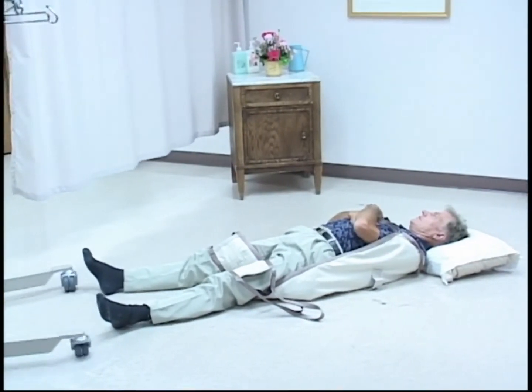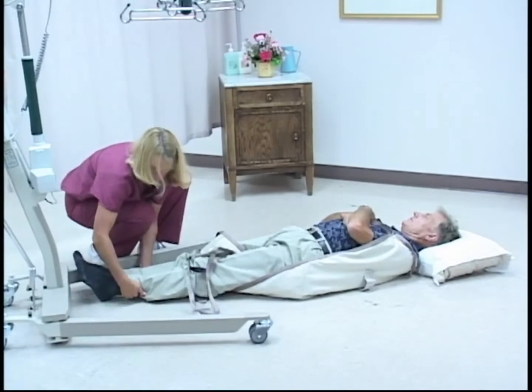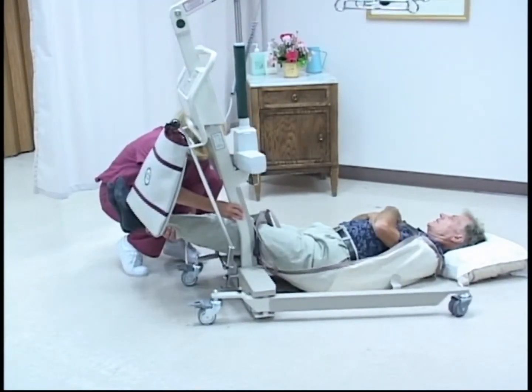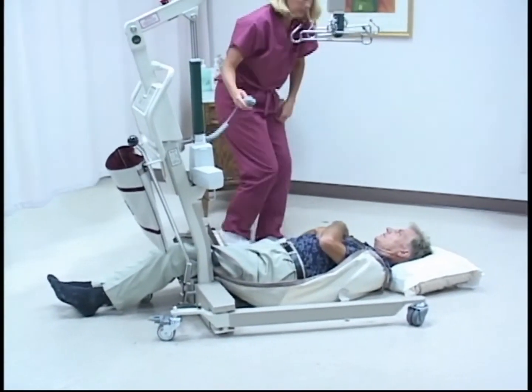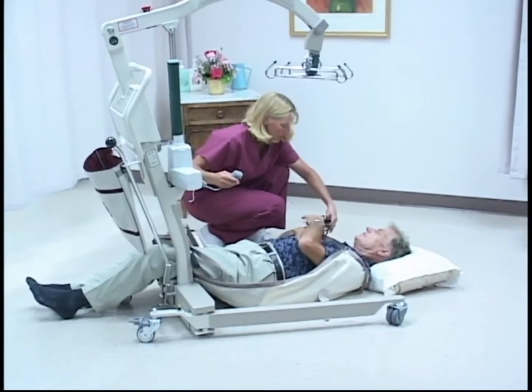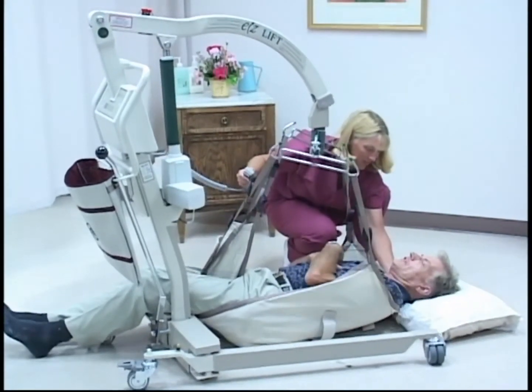Move the lift into position around the patient. Lift the patient's legs to one side, pushing the lift forward until the green nose cone is centered on the patient's chest. Then lay the patient's legs over the base of the unit. Lower the lift boom and hook the straps to the lift hangers using the longest loops and shoulder and leg straps. Support the patient's head and start lifting the patient.